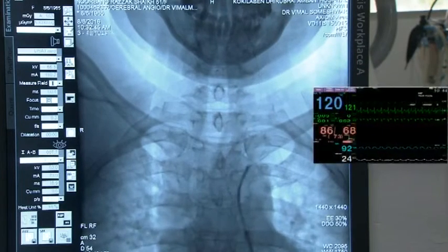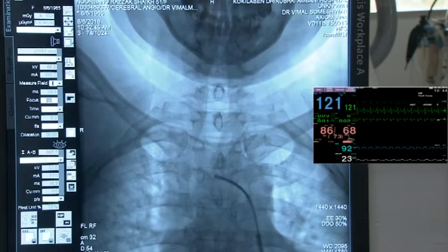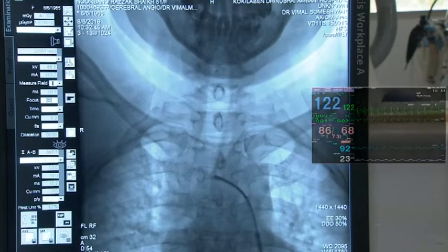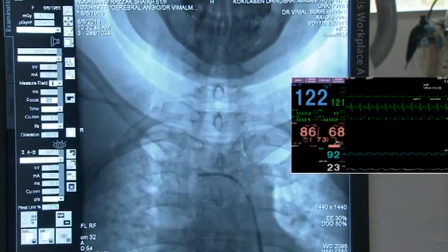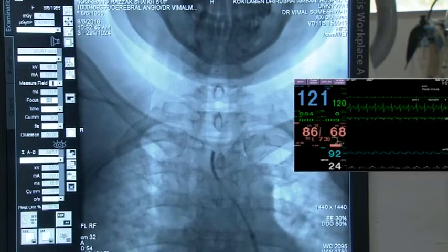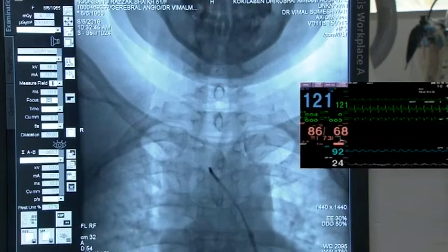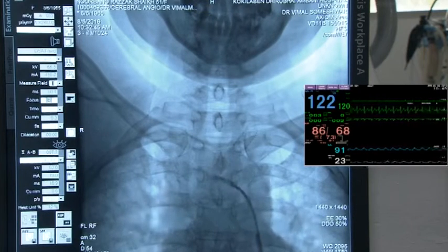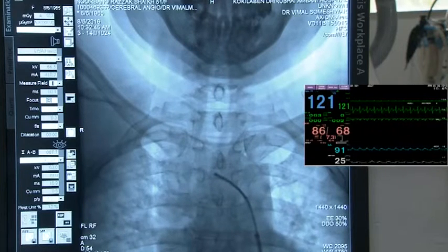Various access routes are used where femorals are not big enough: transapical, direct aortic, or subclavian, right or left. Also there are people who have done transcarotid or through the vena cava approach. And what has been shown is that yes, immediately you decrease the gradient significantly to almost single digits, and you're done. So where do you decide who should go for surgery, who should go for TAVR? And so this actually is based on the STS risk score.